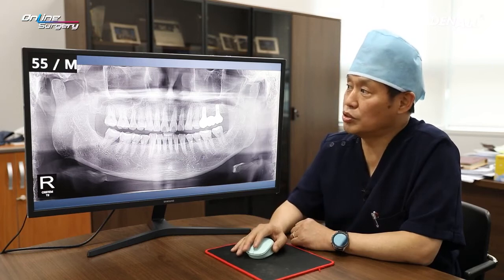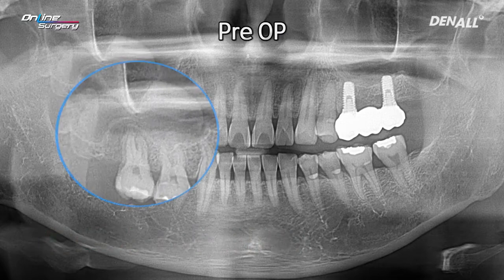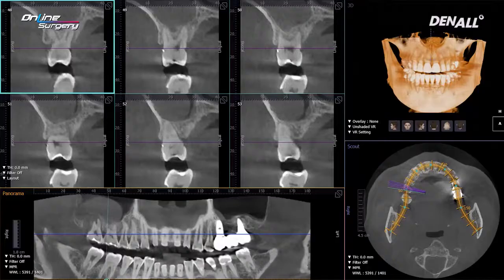This is the panoramic X-ray upon the patient's initial visit. A 55-year-old male patient — number 17 showed severe mobility and pain. On the panoramic image, there is a lot of alveolar bone destruction around number 17, and there is a dome-shaped mucosal lesion within the sinus cavity.